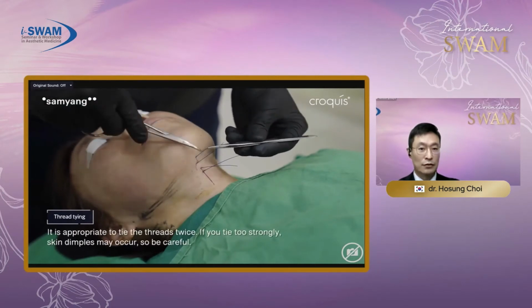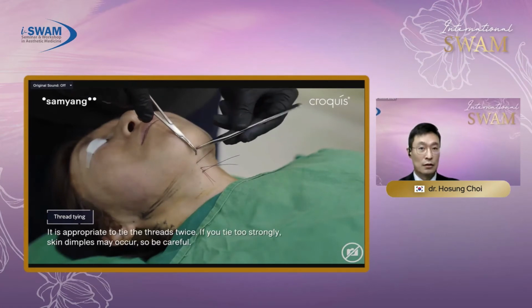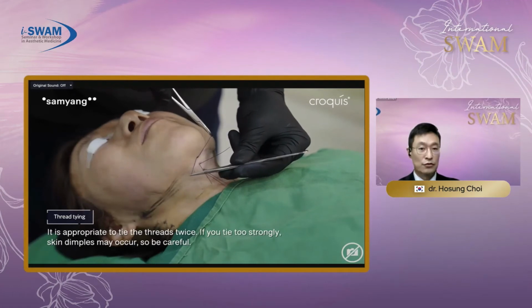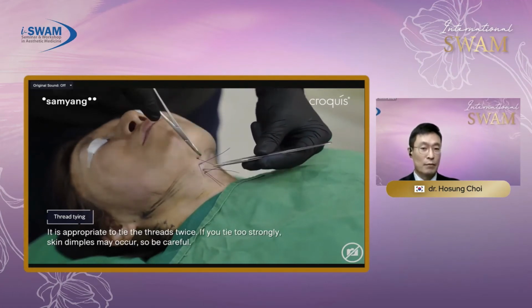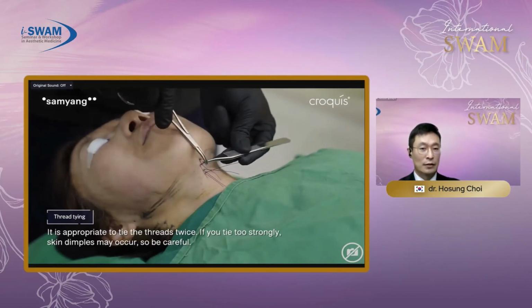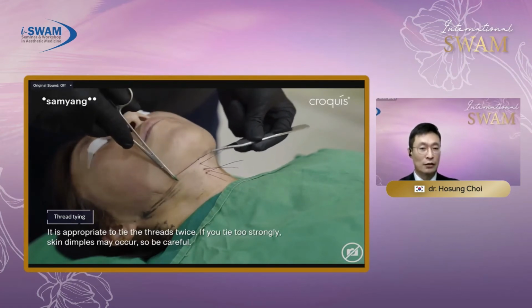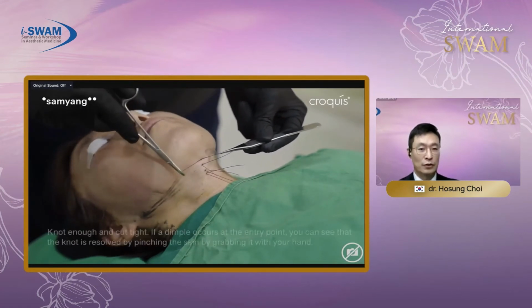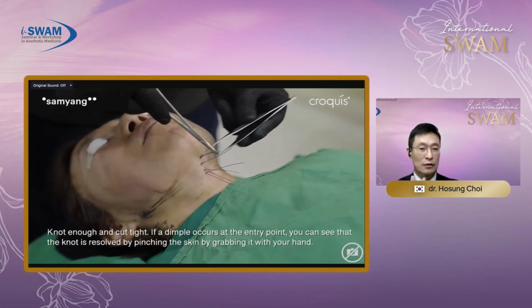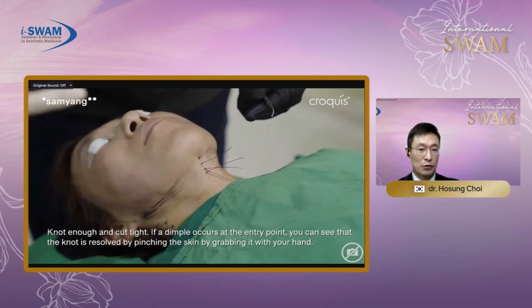Now I'm tying 2 threads. Do not tie too tightly. However, you should tie twice at least. Three times, you can tie 3 times, but the size of the knot will be too large, and the patient can touch the knot on the skin. I think twice is most appropriate.